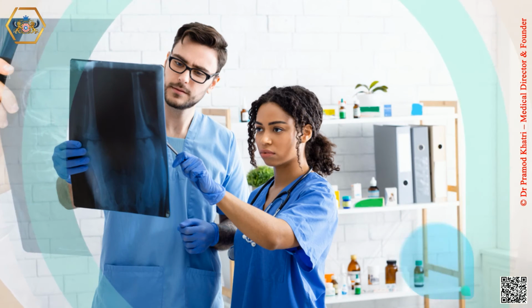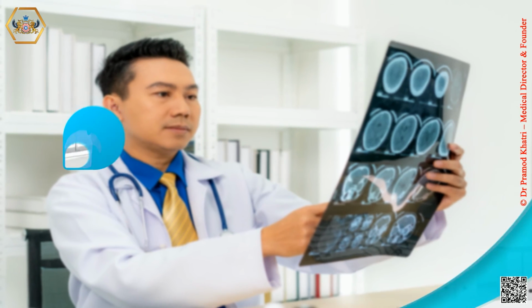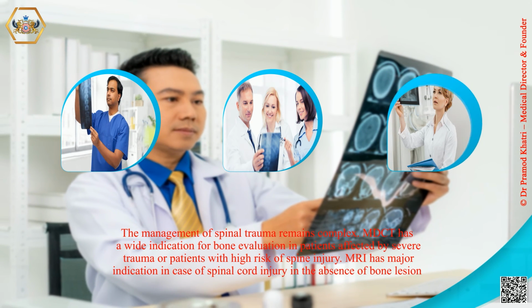MRI has also an important role in case of discordance between clinical status and CT imaging. In the absence of vertebral fracture, patients can suffer from back pain resistant to medical therapy, owing to bone marrow traumatic edema that can be detected only using STIR sequence on MRI. The management of spinal trauma remains complex.